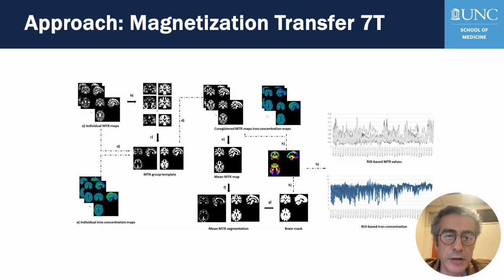Okay, so we will continue with the in vivo applications. In this presentation, I will try to focus mostly on ultra high field. The first application will be magnetization transfer at 7 Tesla. In this study, we recruited subjects 3 times to see how reproducible the magnetization transfer based myelin imaging methodology is using Rosette trajectories.